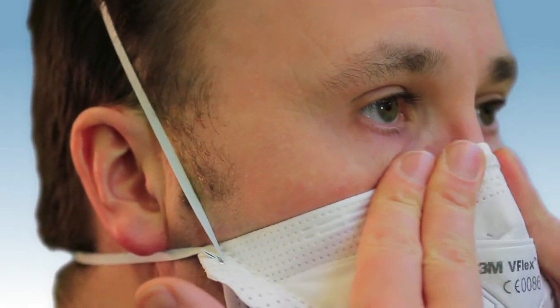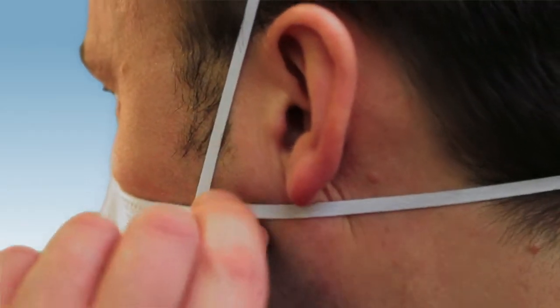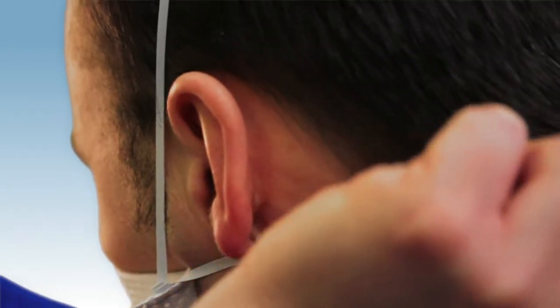If you feel the air has leaked around the nose, readjust the nose clip. If you feel air leaking elsewhere, work the straps back along the sides of the head.